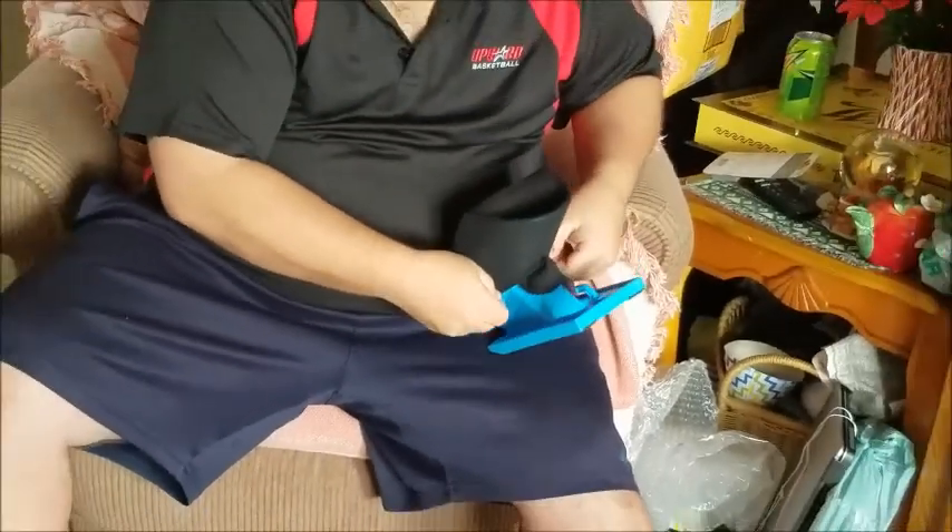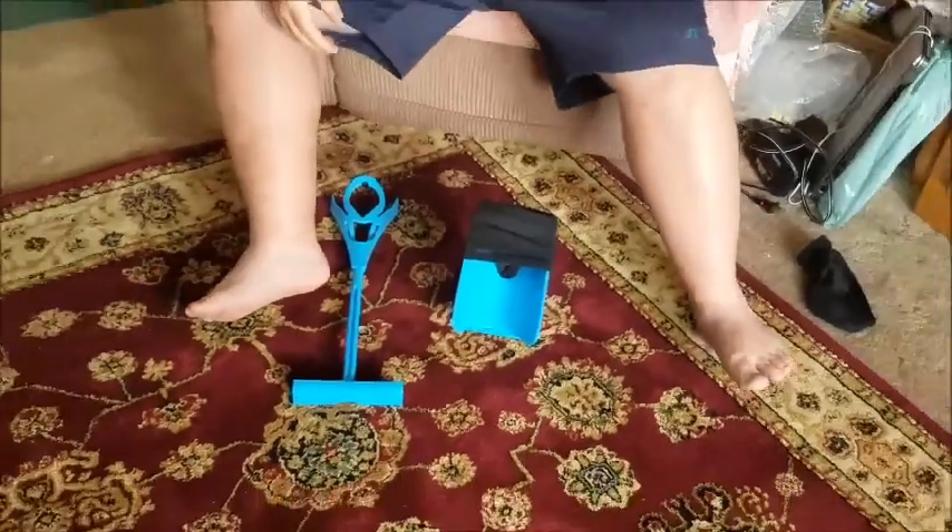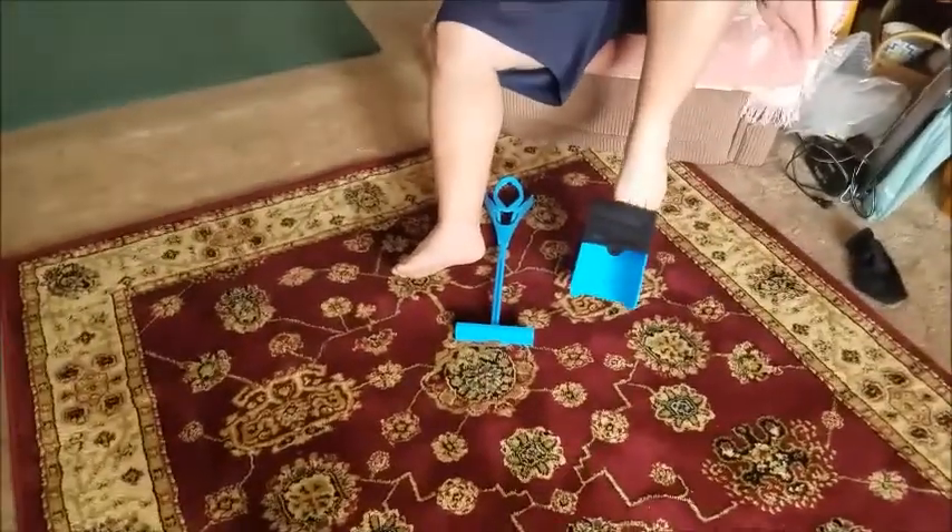You pull this down onto it as far as possible, and then you lay it down on the ground. And the only thing you do is just slide your foot into it.